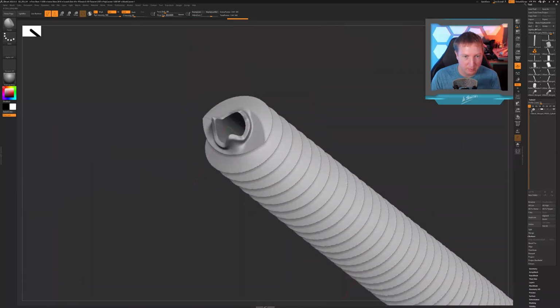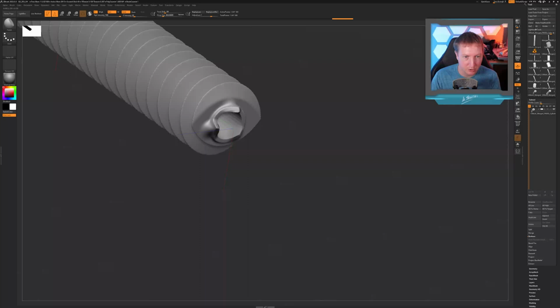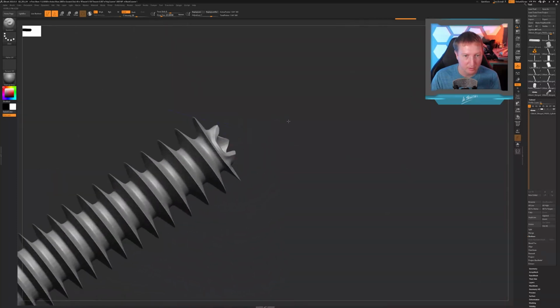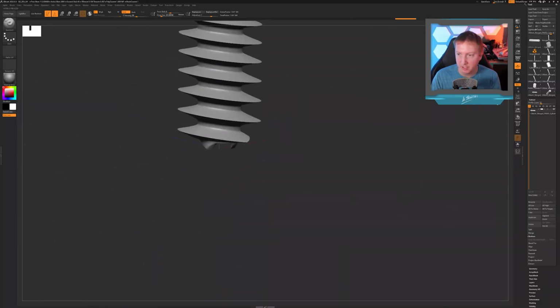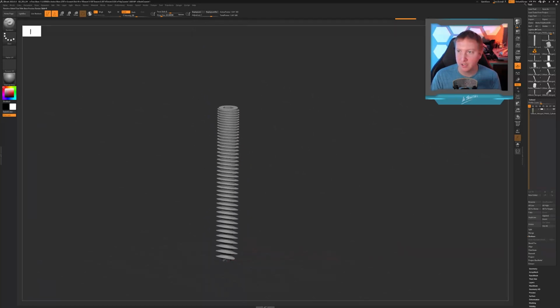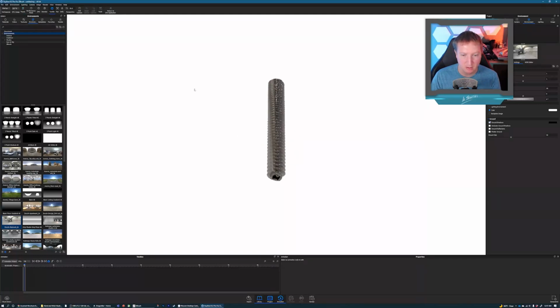All right, that looks pretty good. Just sharpen these up a little bit. I'm no drill expert here. I don't know why I got that little bump there. Let me just smooth that down. All right, good enough. I don't think anyone's going to scrutinize that drill bit tip too much. All right, so let's send that over to the renderer. We'll populate it in here, and voila, we have got an Acutrak screw. Probably a few too many threads here, but otherwise, I think this screw turned out pretty good.